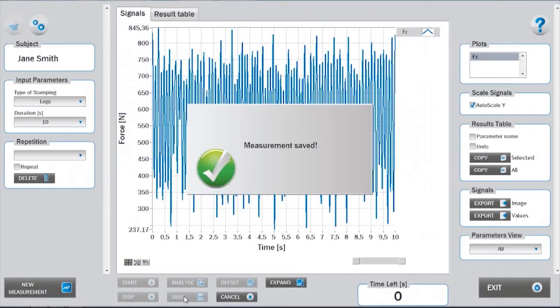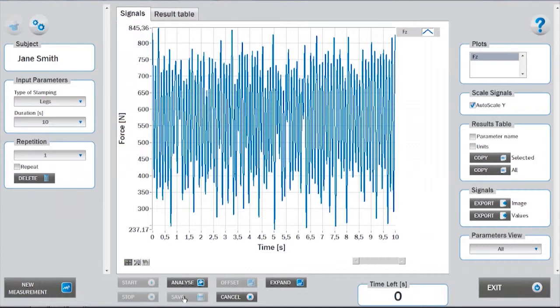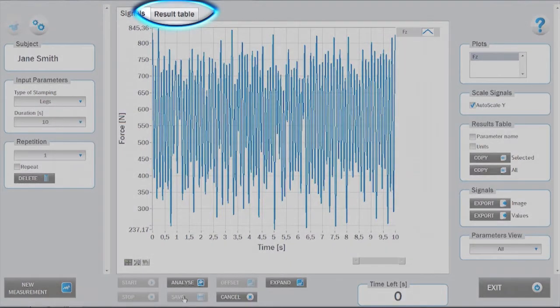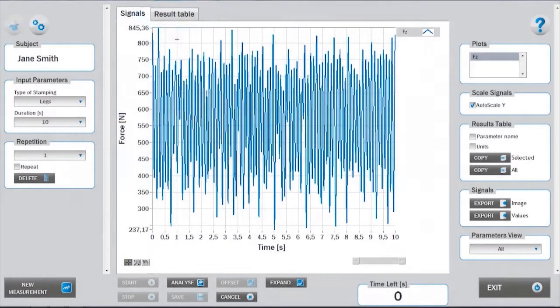The central window displays the ground reaction force of the whole task. The data from the analysis can be viewed under the results table tab.